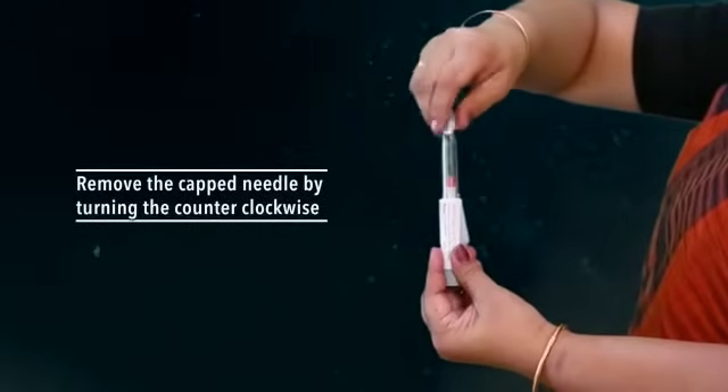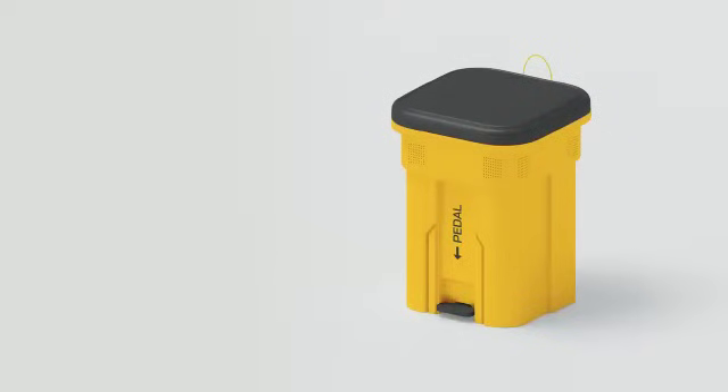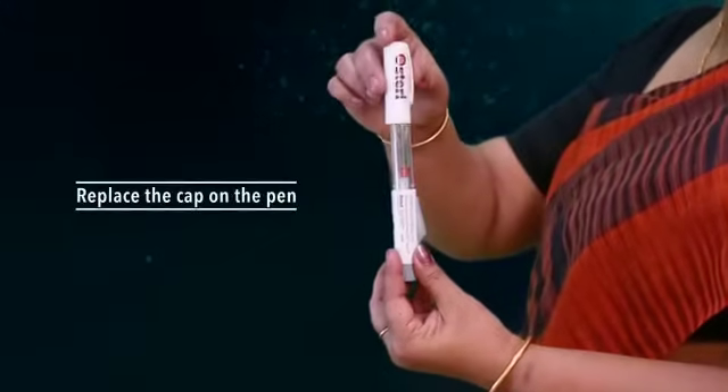Remove the capped needle by turning it counter-clockwise to the left. Number two: throw it in a dustbin or as directed by your healthcare professional.